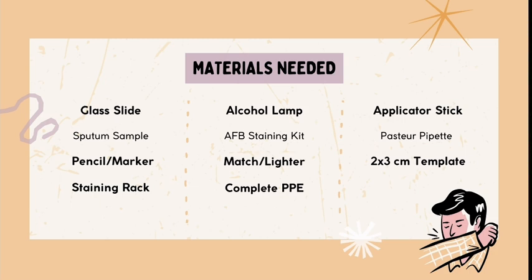So sputum specimens must be collected in appropriate containers. It can be a 50 ml plastic screw-capped transparent container, which is usually used to foster a secure containment. The transparency of the container allows for visual inspection of the specimen to assess its consistency and quality. Appropriate labeling of the sample with the patient's name and date of the collection must be ensured. The collected sample should be stored at 2 to 8 degrees Celsius until transported to the laboratory.